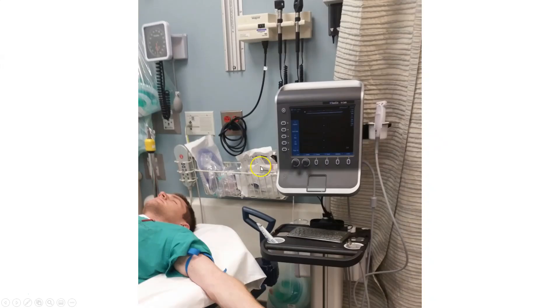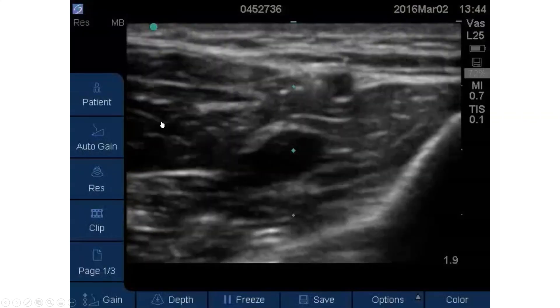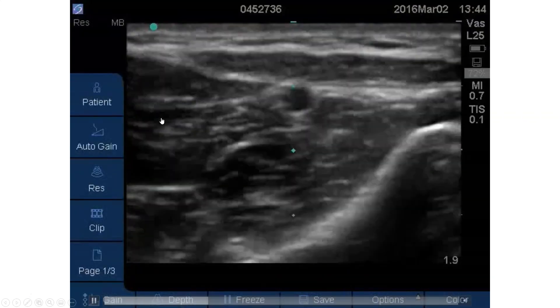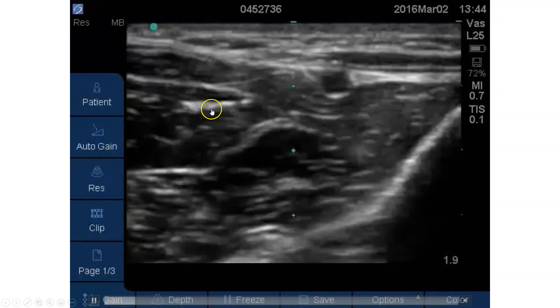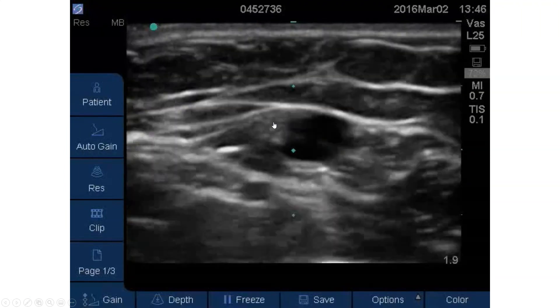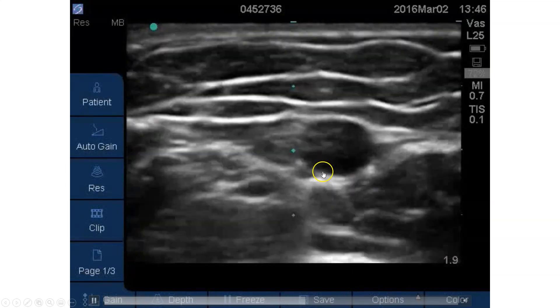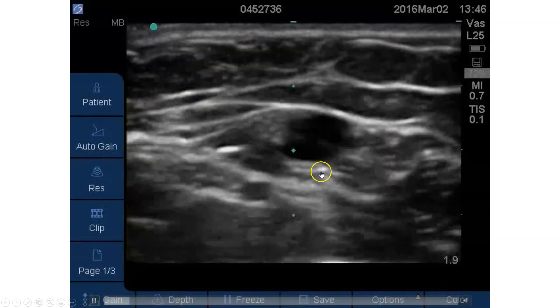Next, make sure you're positioned well — preferably pushing the machine to the other side of the patient. Use a tourniquet. Here's what a vessel looks like without a tourniquet and with a tourniquet. Sometimes you might even need two tourniquets. And finally, what is most critically important is where the vessel runs — you can see a vein that teeters off to the left as you're tracking it, whereas a better vessel stays right in the middle of the screen and moves only very slightly left and right.